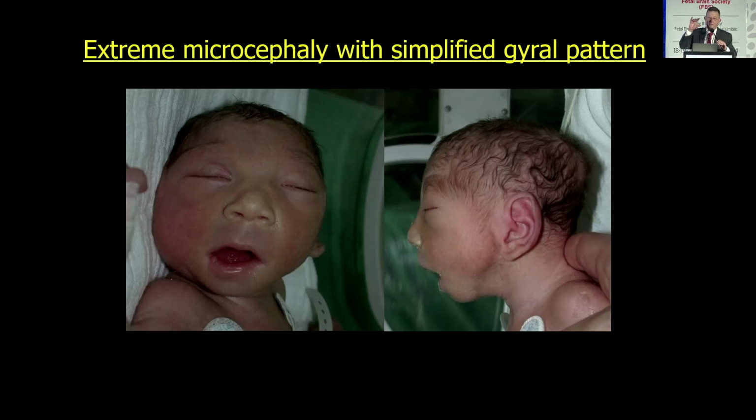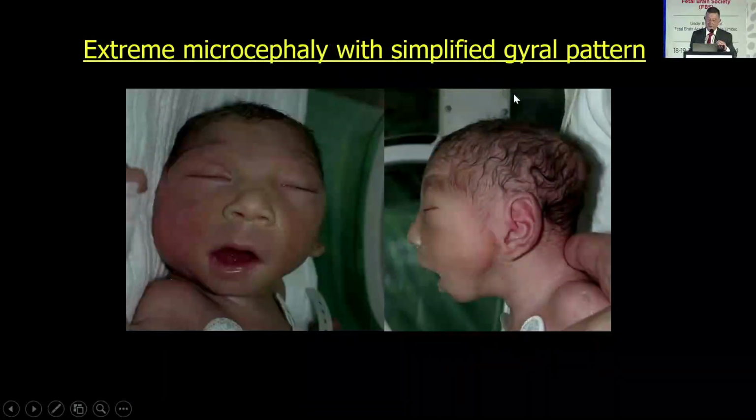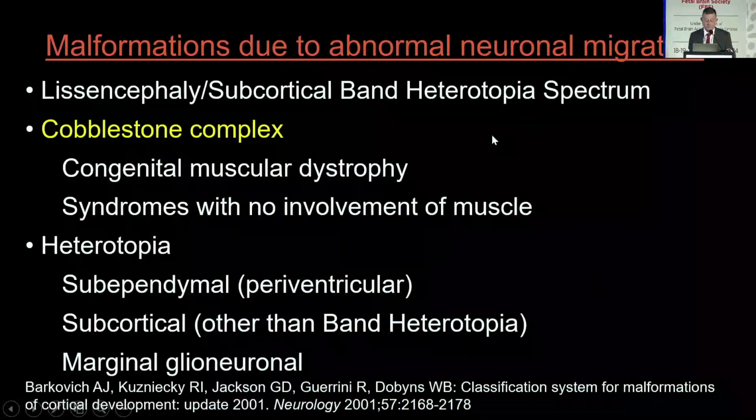If you see something very, very small, you can confirm that by measuring the distance from the base of the cranium to the bregma. Again, you understand that something here is very wrong. And when you see the child, he does not have a big ear, but a very small brain, or calvarium.